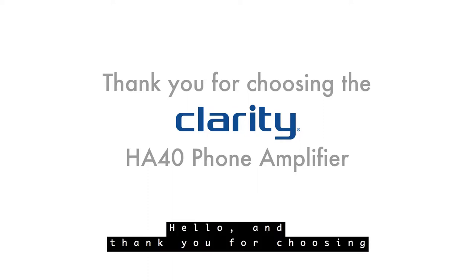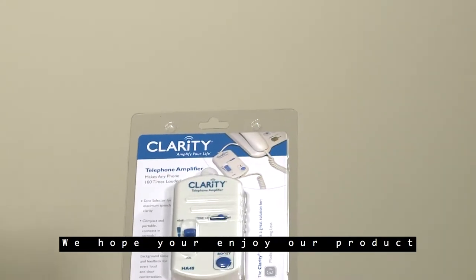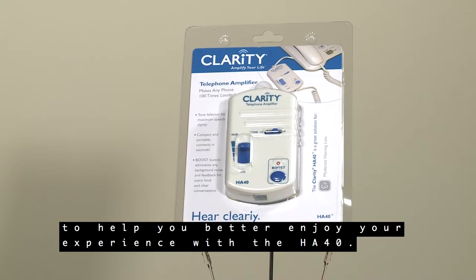Hello, and thank you for choosing the Clarity HA40 phone amplifier. We hope you enjoy our product and want to give you a little bit of information to help you better enjoy your experience with the HA40.